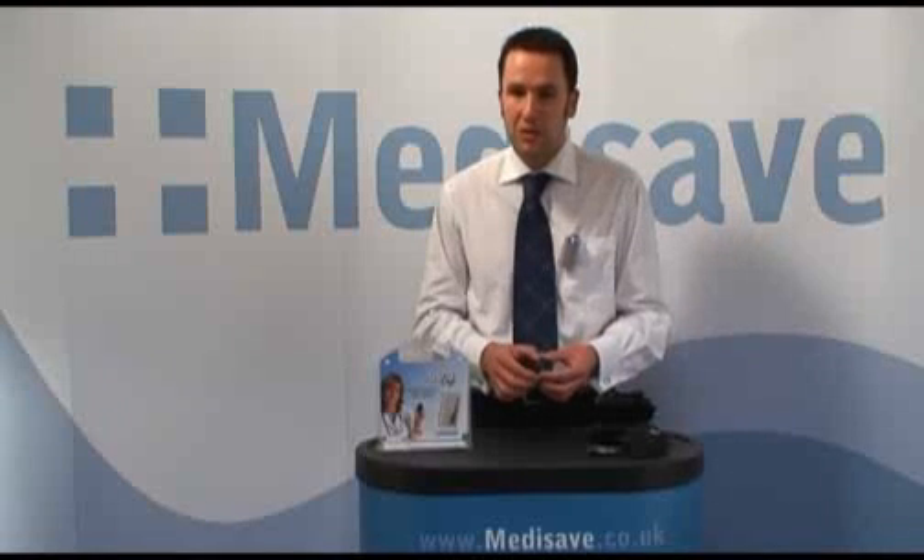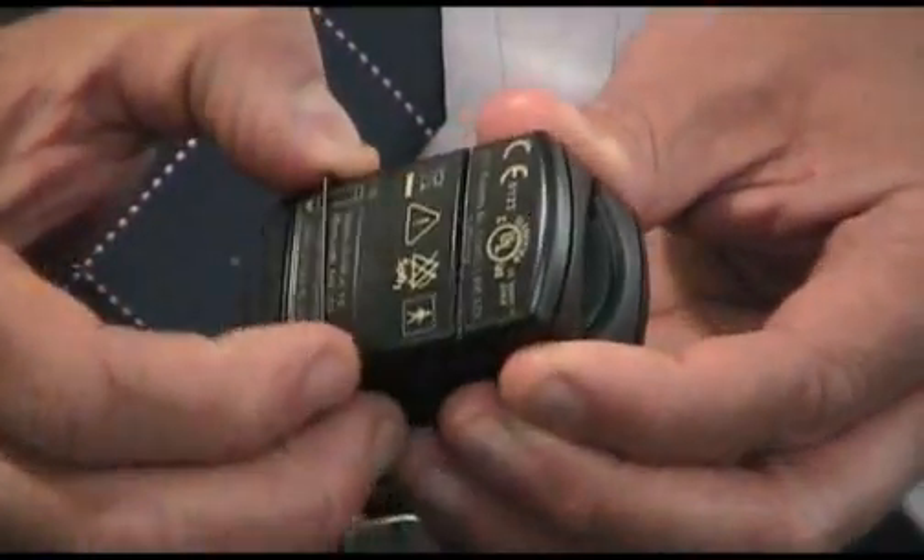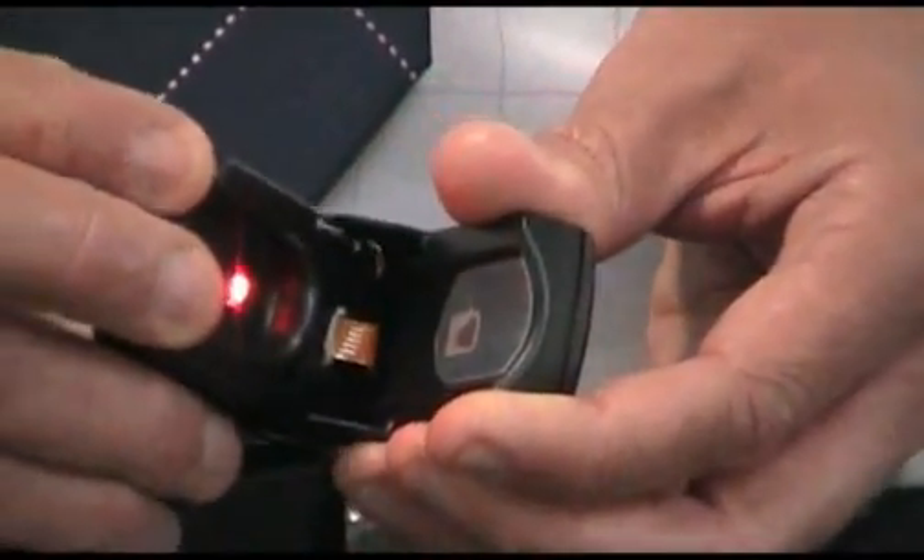To clean the unit is very simple. An alcohol swab or soap solution can be used. You just pull back the spring here and it will open up.